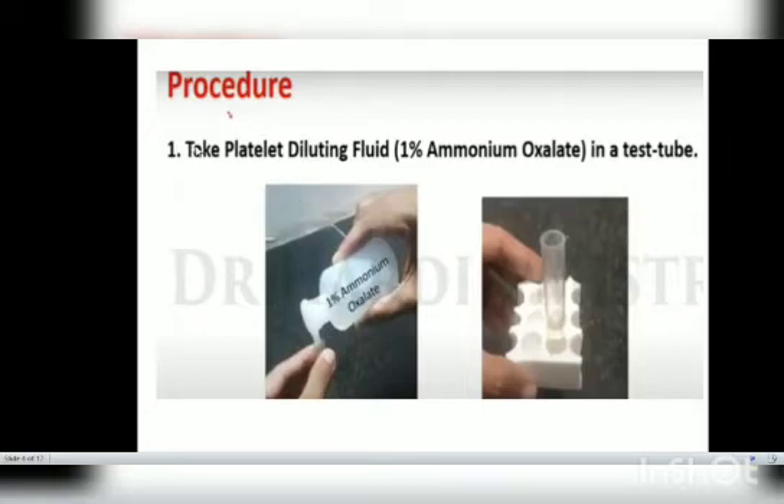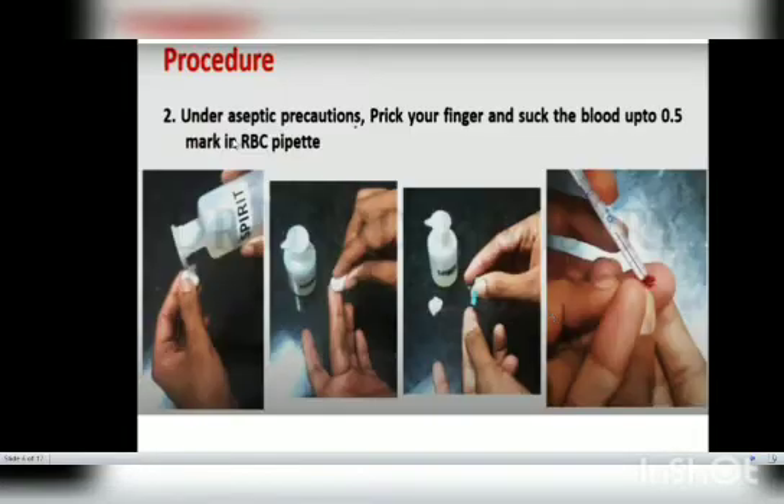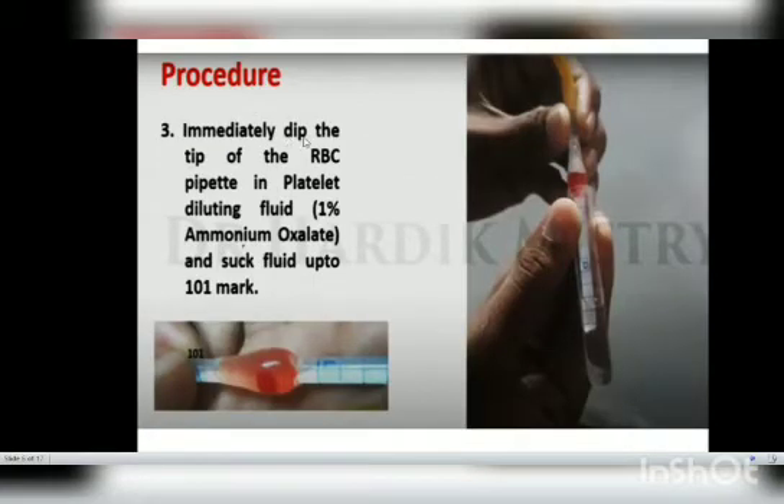The first procedure step is to take the platelet diluting fluid in a test tube. Then, under aseptic precautions, prick your finger and suck blood up to the 0.5 mark of the RBC pipette. Immediately dip the tip of the RBC pipette into the platelet diluting fluid — that is 1% ammonium oxalate — and suck up the fluid up to the 101 mark.